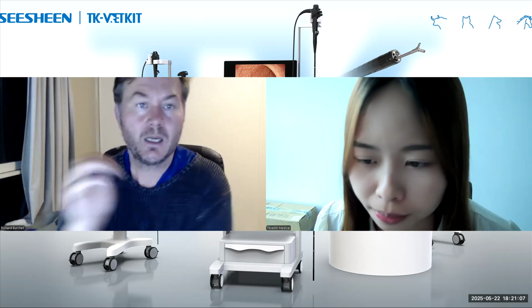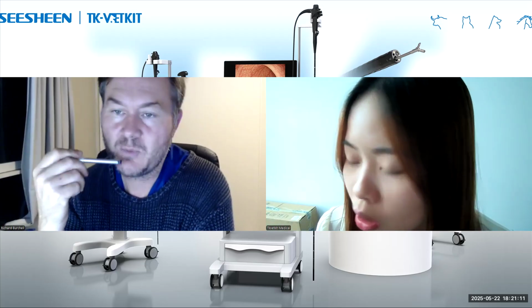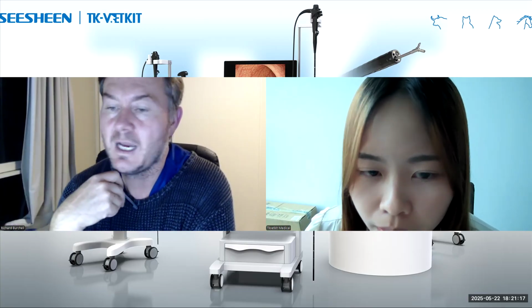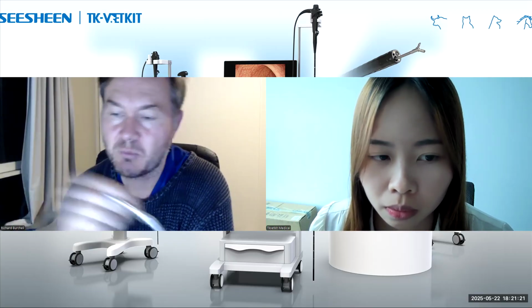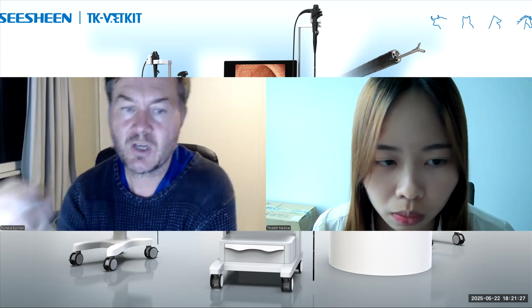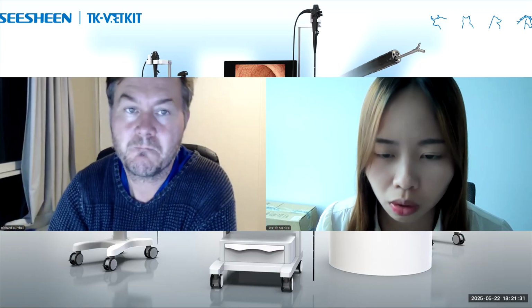Yeah, I think I answered that one, which was that obviously I don't scope large animals, but the principle is just how big your scope is. So if your scope is occluding more than 50% of the trachea, so that it's going to be difficult to breathe past it, then I think you do need oxygen. But if you've got a scope with plenty of room around it that the animal can breathe in, then I don't think that oxygen is imperative. Okay.